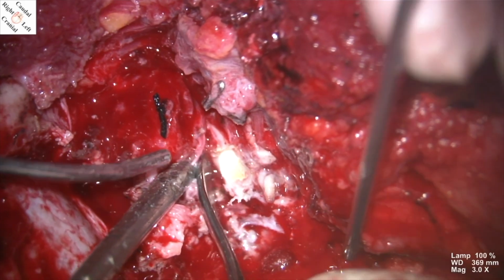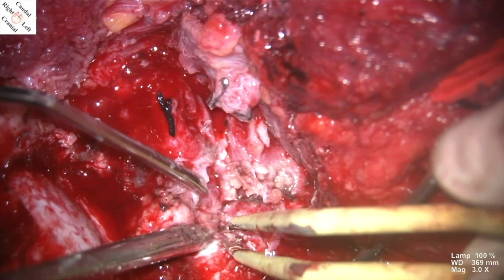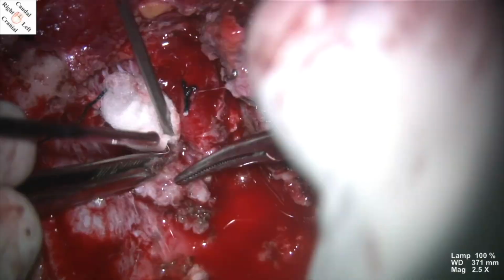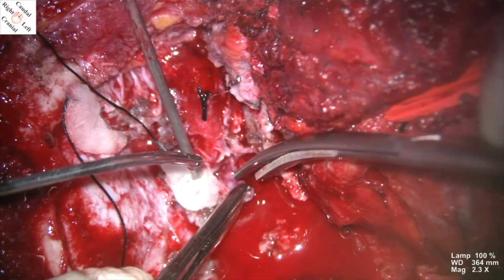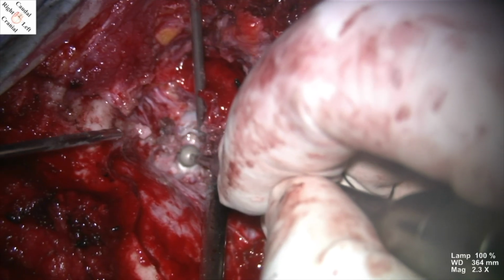Further subperiosteal dissection was done along the sulcus arteriosus till the lateral mass of C1 so as to complete the C1 hemilaminectomy. The remaining extradural tumor surrounding the V3 segment of the vertebral artery was meticulously dissected and taken out in a piecemeal fashion, ensuring the preservation of the arterial wall. The vertebral artery is then mobilized and paracondylar drilling is done.